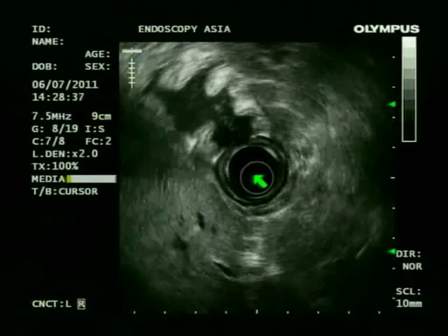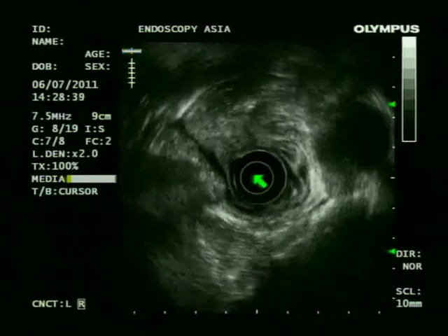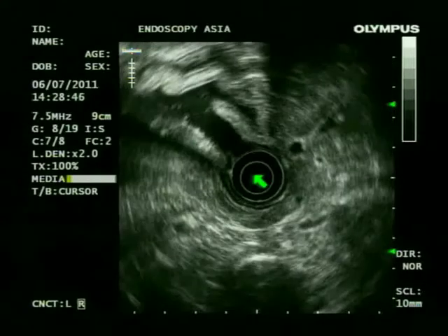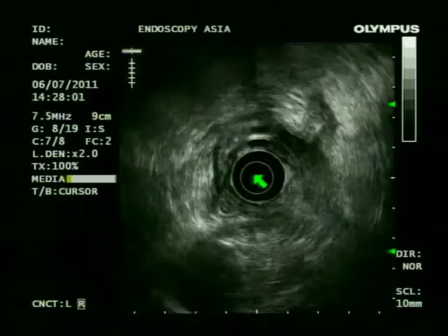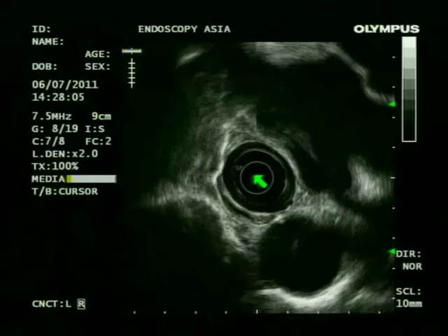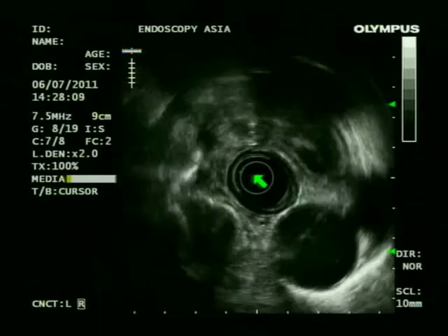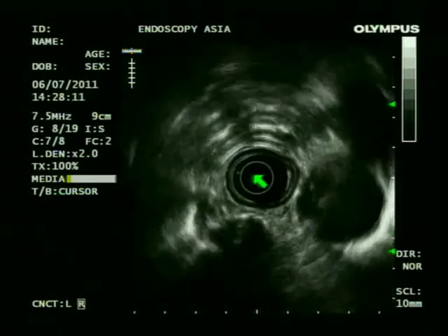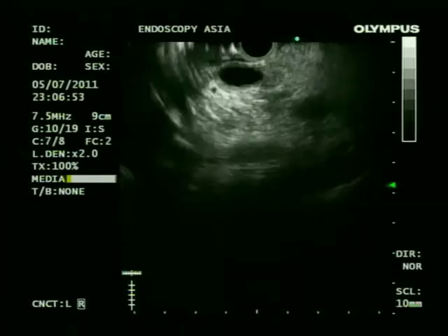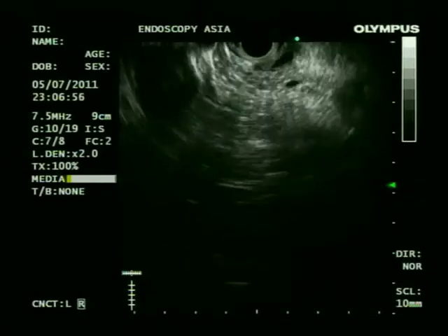This signifies common hepatic duct involvement. There are no obvious hypoechoic lesions seen in the left lobe of liver, which we can also see in malignant lesions. So a very effective evaluation of the mediastinum, lymph nodes, and left lobe can be done.